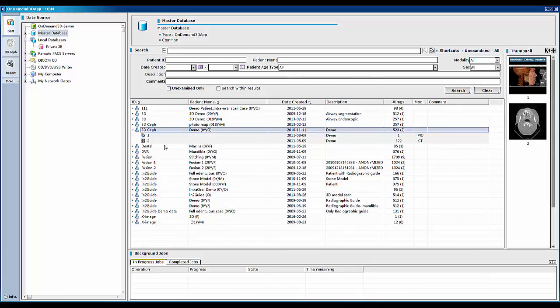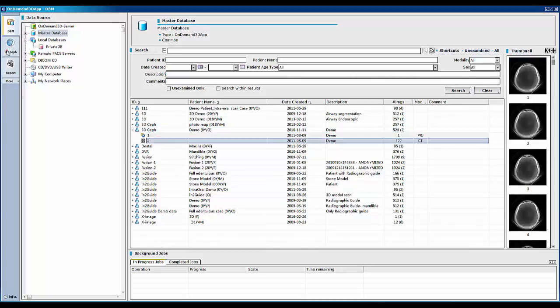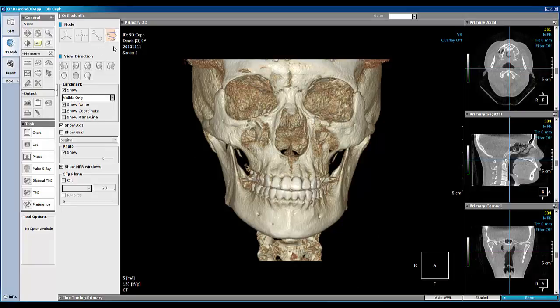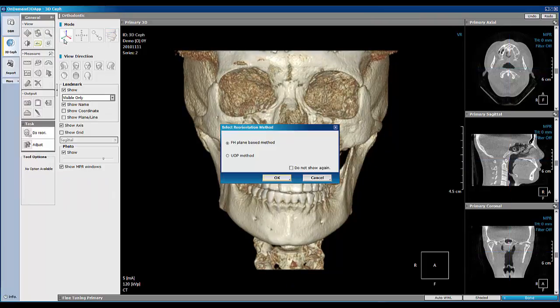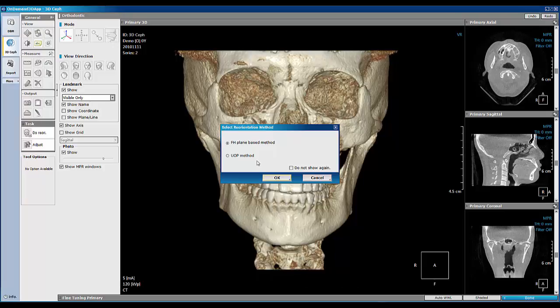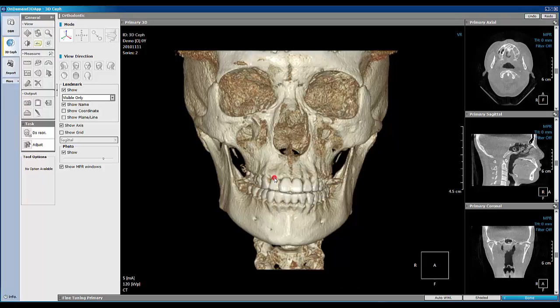First, select the study data from DBM and load the data with the 3D Ceph module. Perform reorientation of data using initial landmark points. Select your preferred orientation method in the dialog — FH plane-based method or UOP method. In this case, I will choose FH plane-based method, then press OK to start.